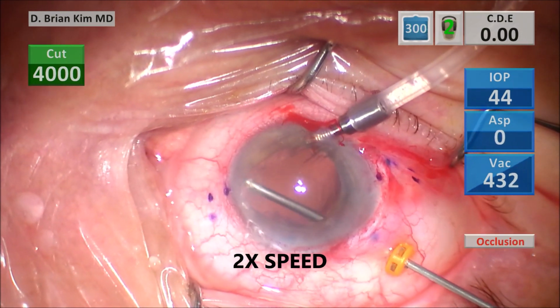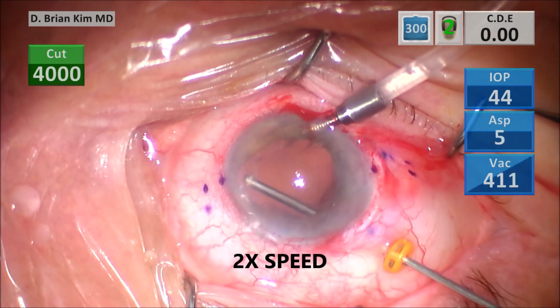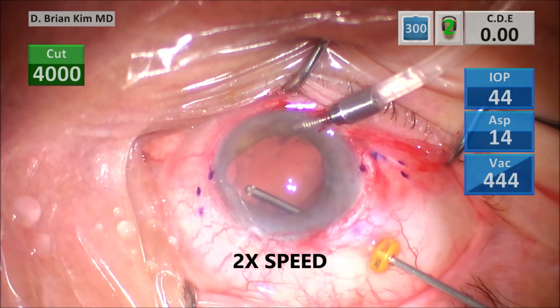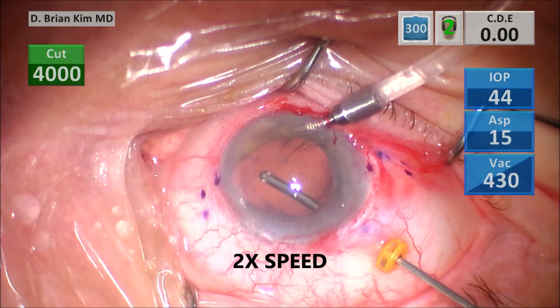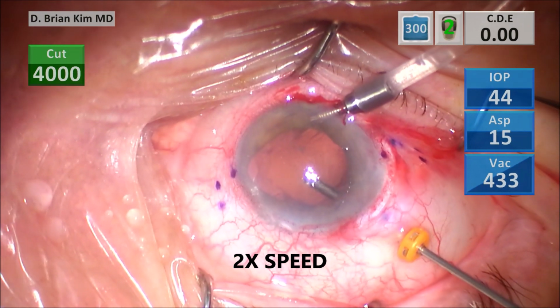And so I'm doing a 2x speed of my vitrectomy here. But again, this patient already had a vitrectomy by their other surgeon, and so I just wanted to be a little bit thorough, and I'm doing a little bit of extra vitrectomy. And even though there's no vitreous here, I'm just wanting to make sure where I'm going to place my scleral needles is definitely clear of any vitreous.